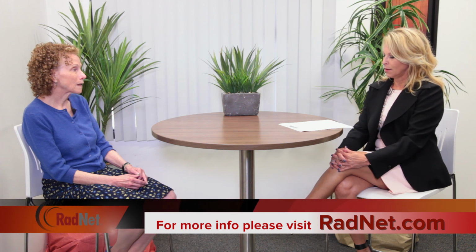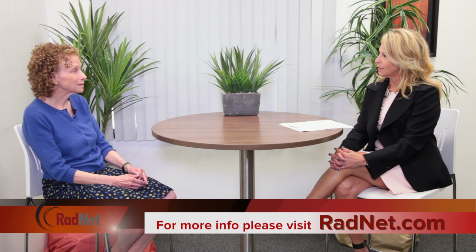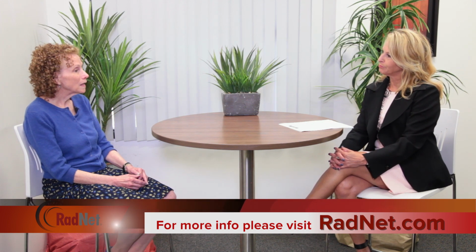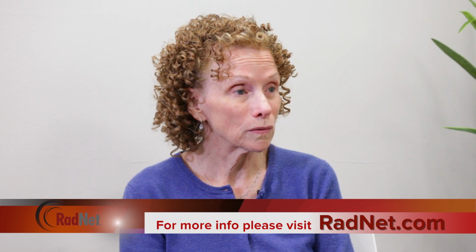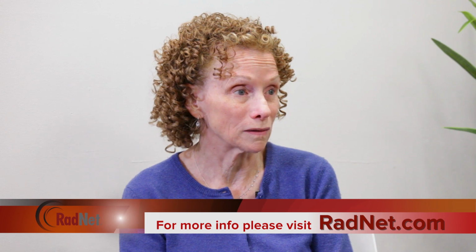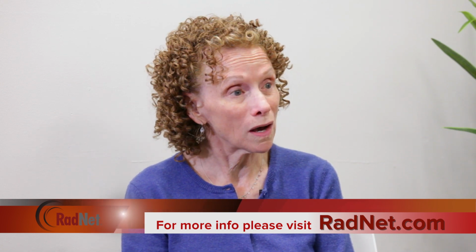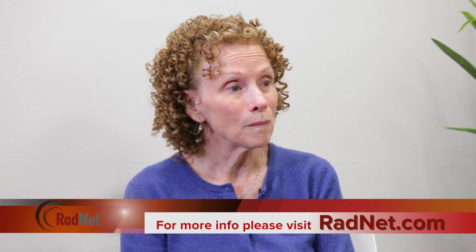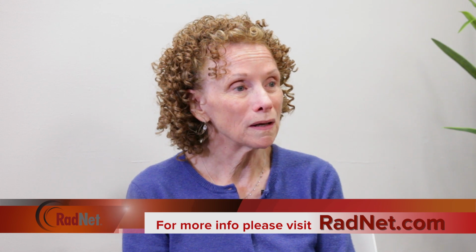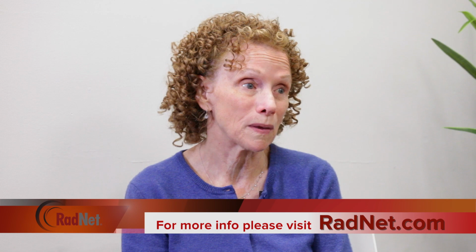Okay. And then we talked about radiologists in another interview that we had. What kind of radiologist would be specific to this type of exam? Well, it's a very difficult exam to interpret, and it should be done by what we call an oncology radiologist or an oncologic radiologist. That is someone who is trained in both the anatomic imaging, which is CT, and also in the metabolic or physiologic part, which is PET. So it should be a radiologist who can interpret both of those exams, and that is a PET CT.